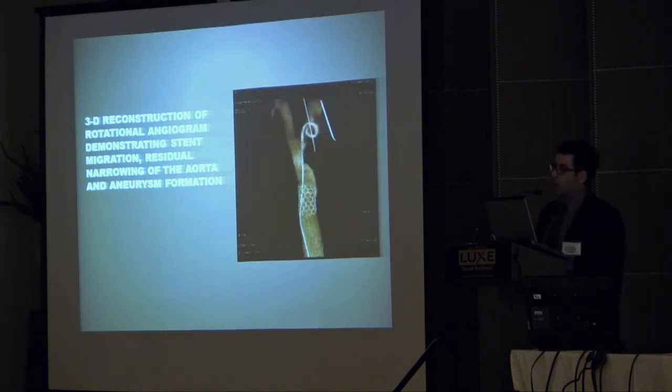What's nice is when you actually do aortic imaging, or you do imaging in the superior vena cava, for example, for a Glenn shunt, is you really don't have to pace very much, because contrast will hang around there a little bit longer.